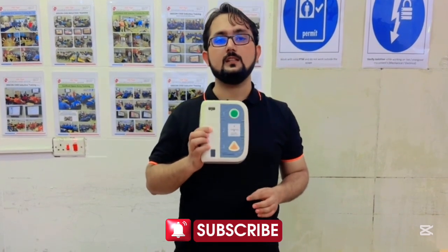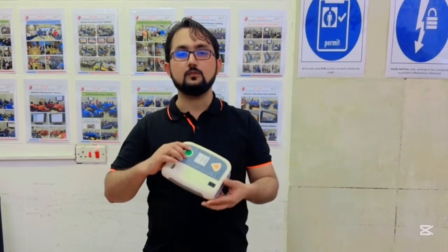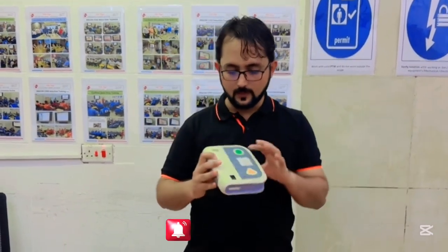In today's video, we will discuss how to use an automatic defibrillator for the CPR process. In a medical emergency, if you don't have an AED device or pads, you have to give them CPR manually, as we discussed in multiple earlier videos. But if you have the AED device or automatic defibrillator, you must use it in the right way.